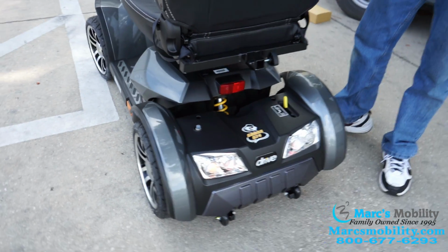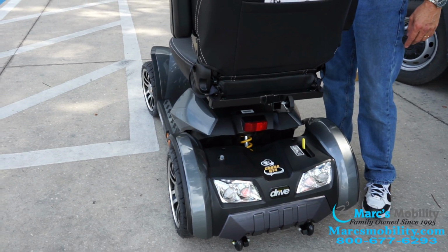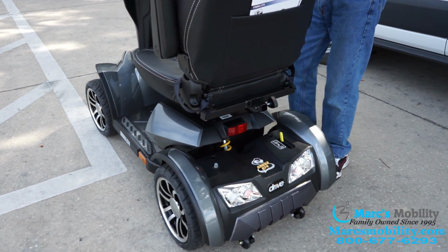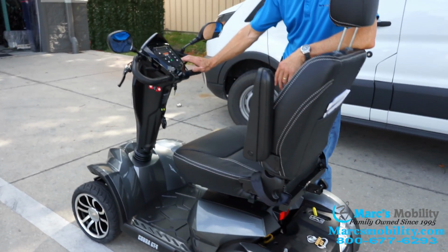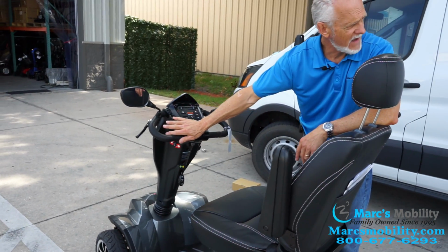So you see your headlights. These are your flashers. The flashers are only in the back. So I'm going to turn the flashers off. So also you have your forward on the dashboard here. You have your forward over here and your reverse on this side.